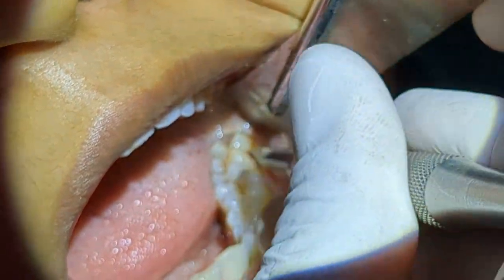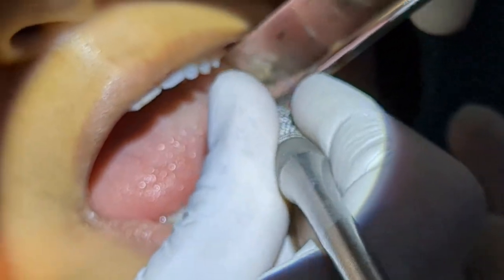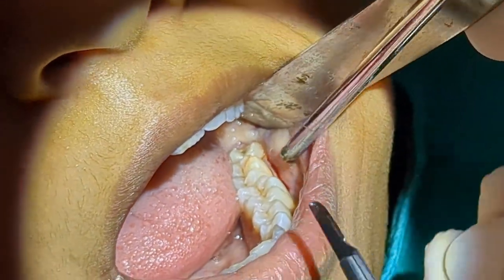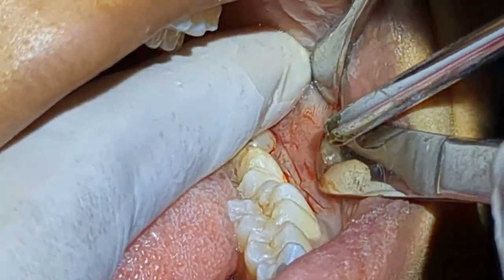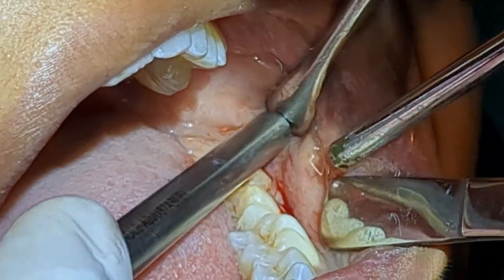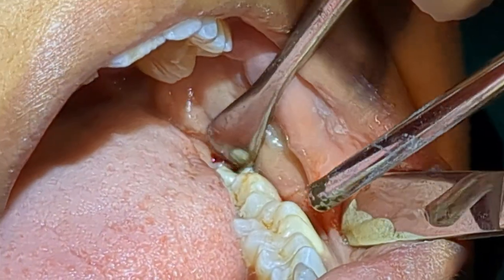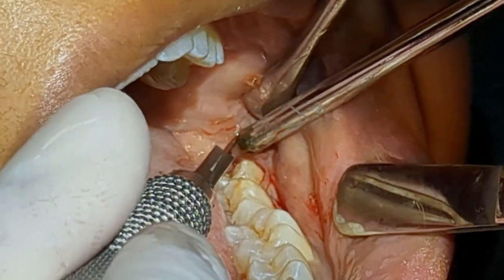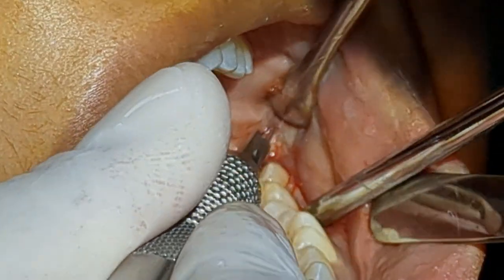I'm going to give a crevicular sulcular incision into the sulcus around it. Another thing to keep in mind is the direction of the anterior border of the ramus — it is somewhere here, let me show you with the instrument. My first incision should go in the buccal direction, and then along the anterior border of the ramus I'm going to give an incision.